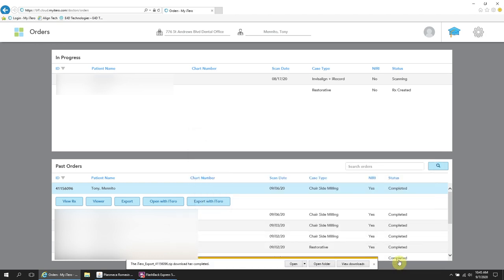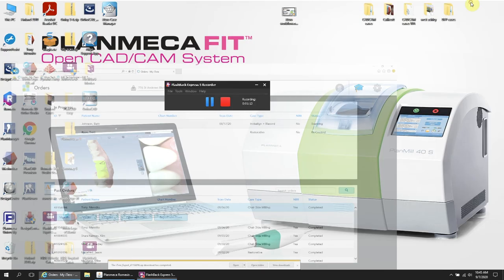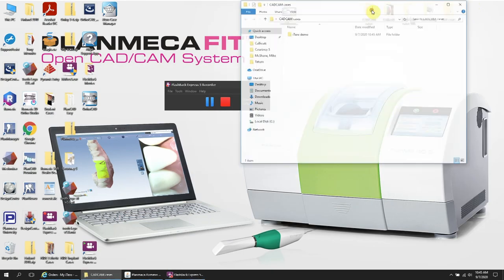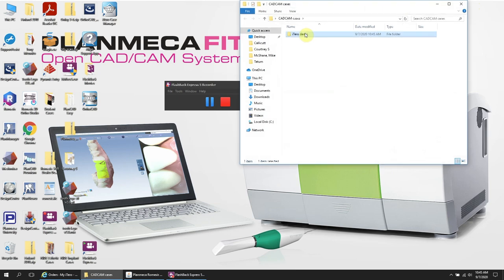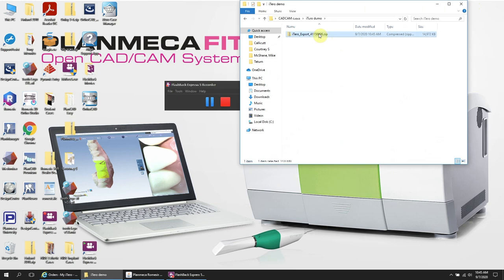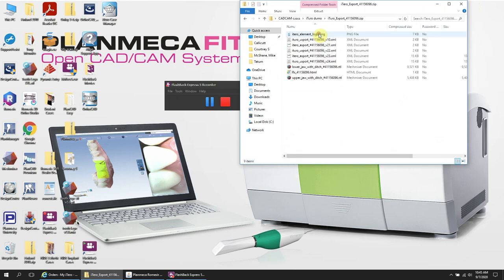Now, it will not export in just the STLs. It exports a lot of different things. So when you open this file, there's actually a zip file that is there. And you need to, you cannot import a zip file into Romexis. So you need to actually segregate those two scans.